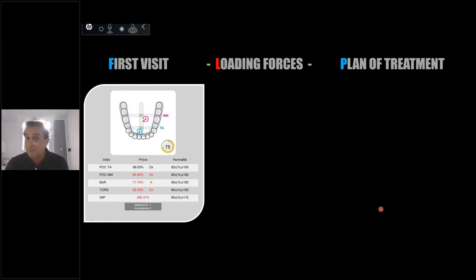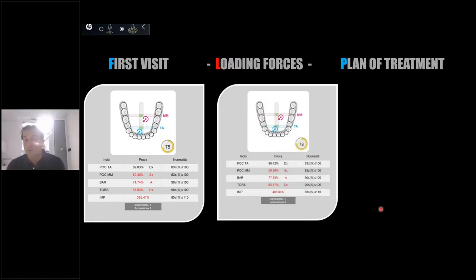So I called my assistant and I said to her, please look with me at the screen and the situation because I have a problem with the Teethan. I think I have a problem. No, I don't have a problem, because you can see on the screen, the last exam, the impact was 406.